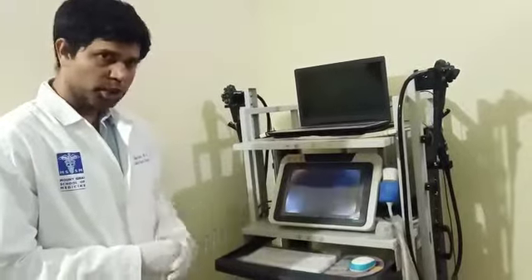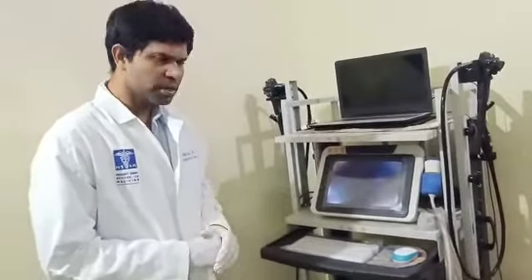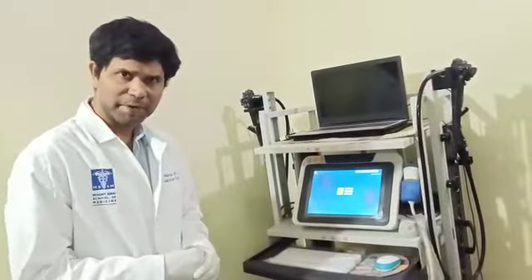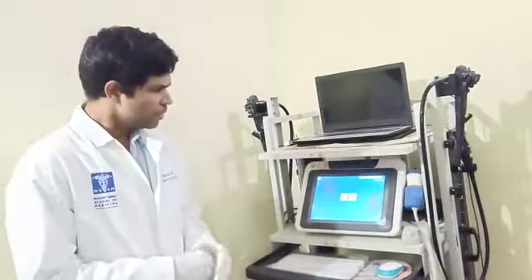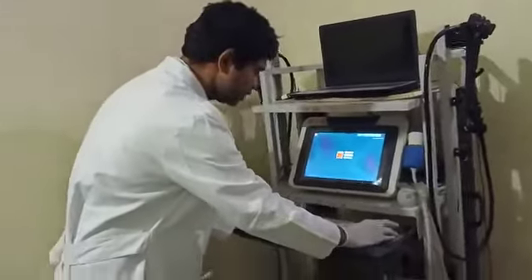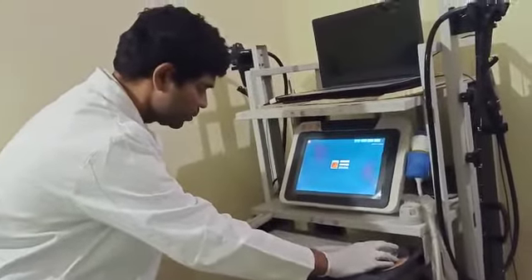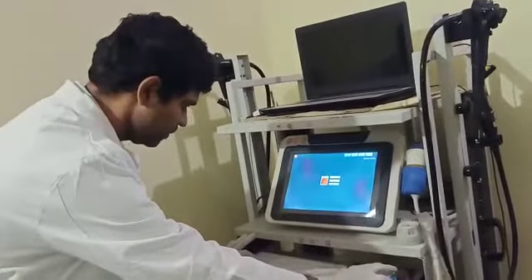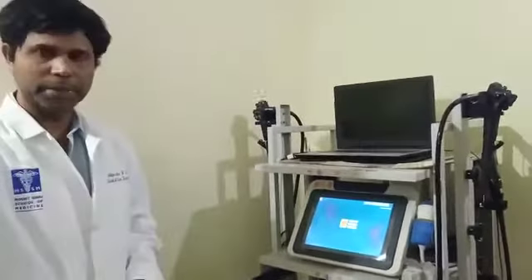The advantage of this FibroScan machine in comparison to other liver tests like blood tests or CT scans is that you get immediate results, and the procedure is so simple you can do it in your clinic. Here we switch on this button and the machine turns on. It asks for your password — you just type 'S' twice and then log in.